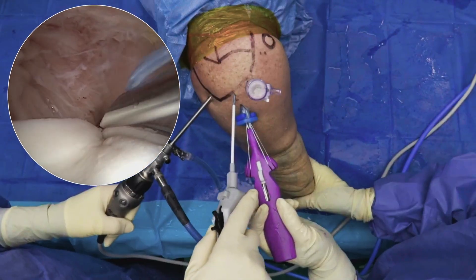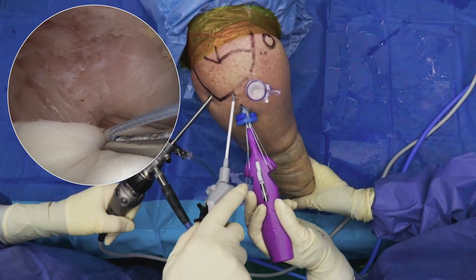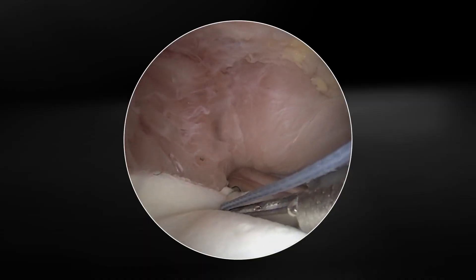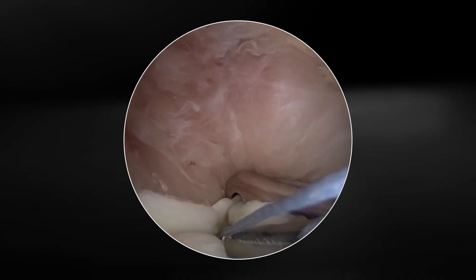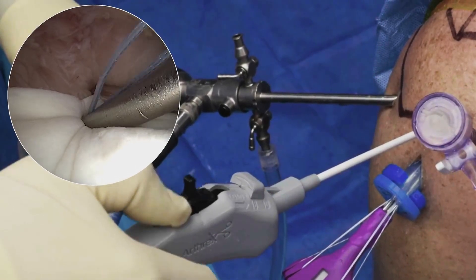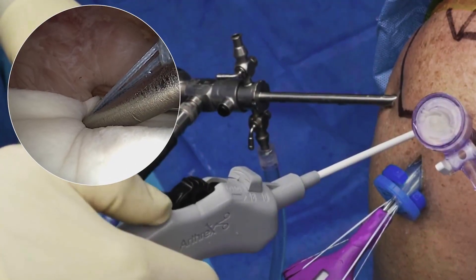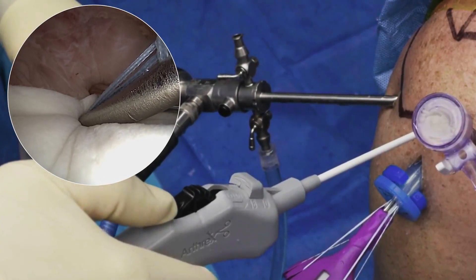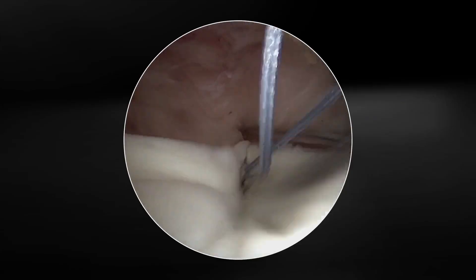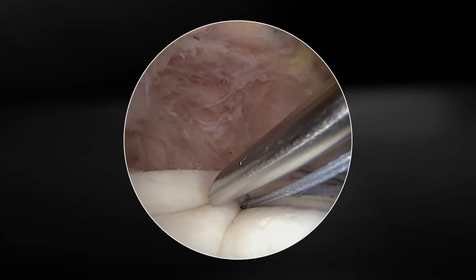The 1.5 millimeter tip is introduced adjacent to the holding suture where the graft is attached to the graft spreader. A forward-directed force with slight pronation and supination helps to insert the device. The FibreStitch wheel is rolled in reverse until a click is heard. The wheel is then advanced forward until another click is heard. The device is gently withdrawn, and the first implant is in place.